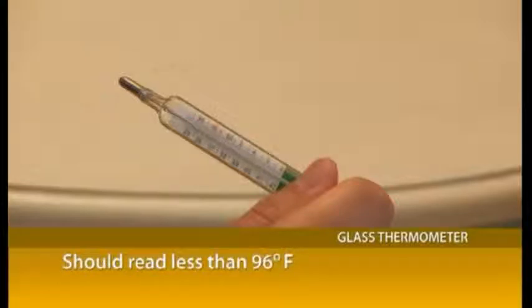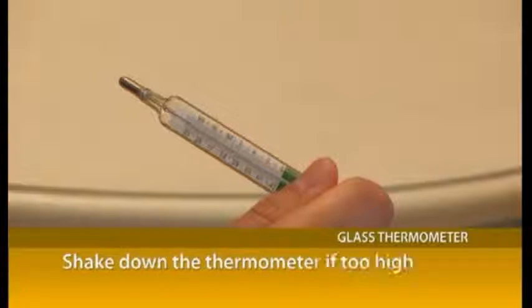The line should read less than 96 degrees Fahrenheit. If the line reads more than 96 degrees Fahrenheit, firmly shake the thermometer downward several times. Shake the thermometer over a couch or bed. This will keep it from breaking if it slips out of your hand accidentally.